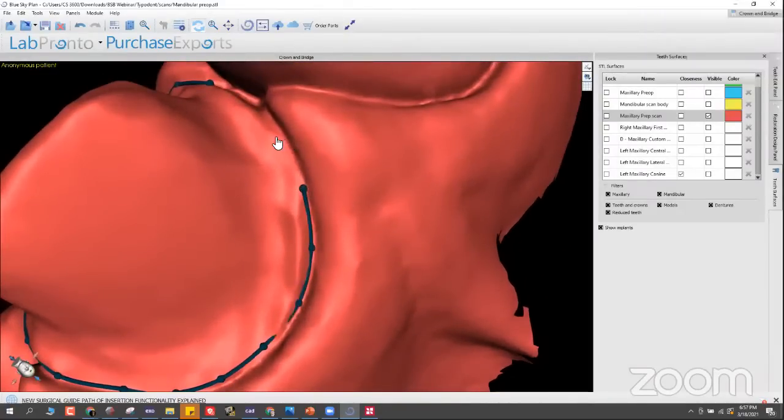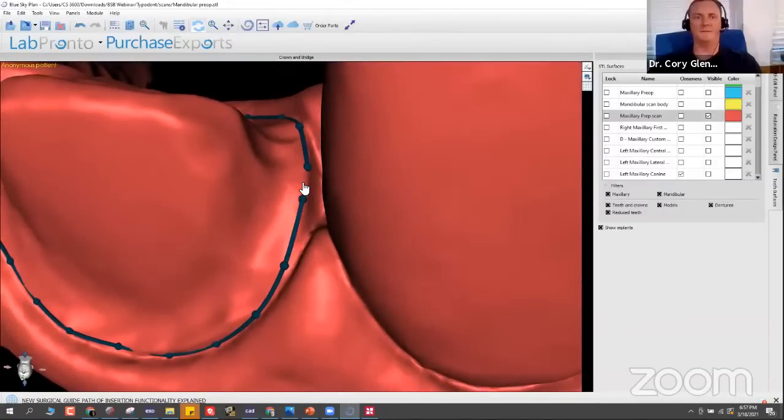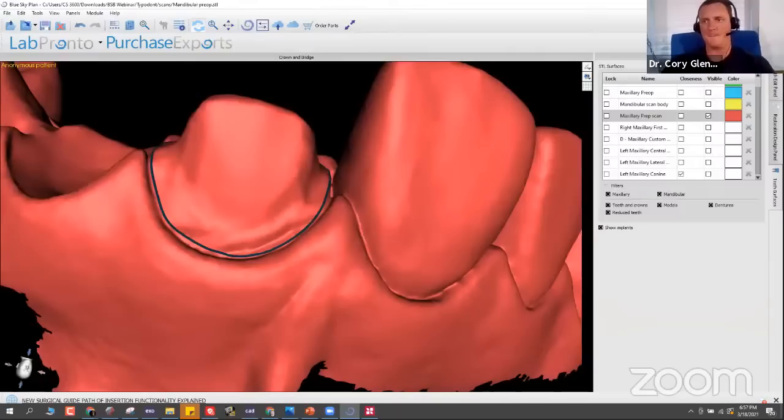Do you buy a selection of shades of the resin or can the color be modified by staining? Both. They do have five or six shades, or you can use composite stains on these. Either one of those will work.